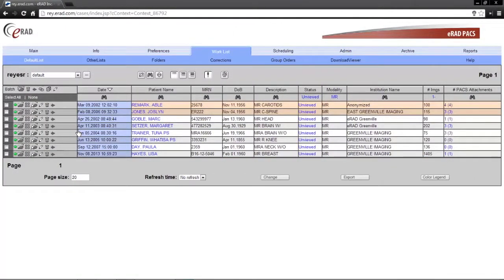The next new feature we will cover is the web viewer. The eRAD web viewer displays images in a web browser and on mobile devices. For browser requirements and details, please refer to the help menu or the eRAD web viewer guide document. The web viewer may be accessed through the quick view page or the work list, depending on specific user permission.